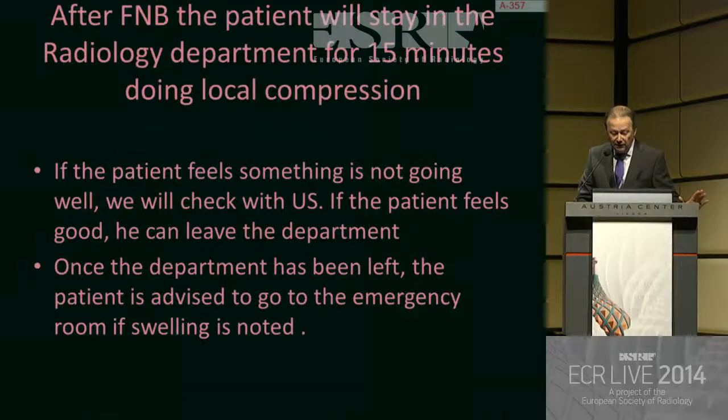After FNB of every patient, we ask the patient to stay in the radiology department for 15 minutes doing local compression. If the patient feels something is not going well, we will check with ultrasound. If the patient feels good, he can leave the department. He or she does not have to say anything to us. Yes, he feels good and he goes.